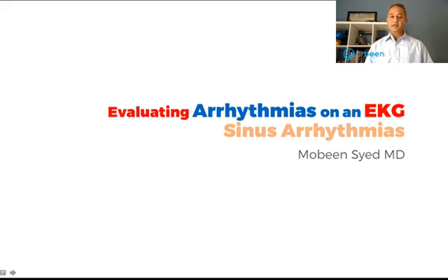Okay, guys, so this is Dr. Mobeen. We are talking about the arrhythmias and evaluation of the arrhythmias. This lecture is part of the interpretation of the EKG. The lecture today is the next step. In this step, we are going to be talking about the sinus arrhythmias.